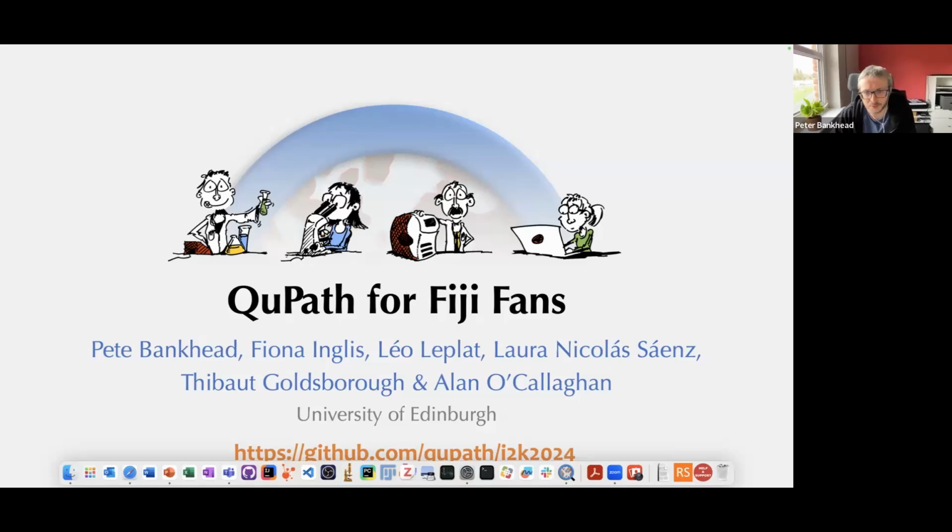And so this workshop is really for people who like ImageJ and Fiji or maybe are familiar with it and are thinking about trying QuPath, or maybe already use both of them but want to know ways to link together the worlds a little bit more. And so that's what we're going to cover in here. Feel free to ask questions in the chat and then we'll have plenty of time to discuss later on today.